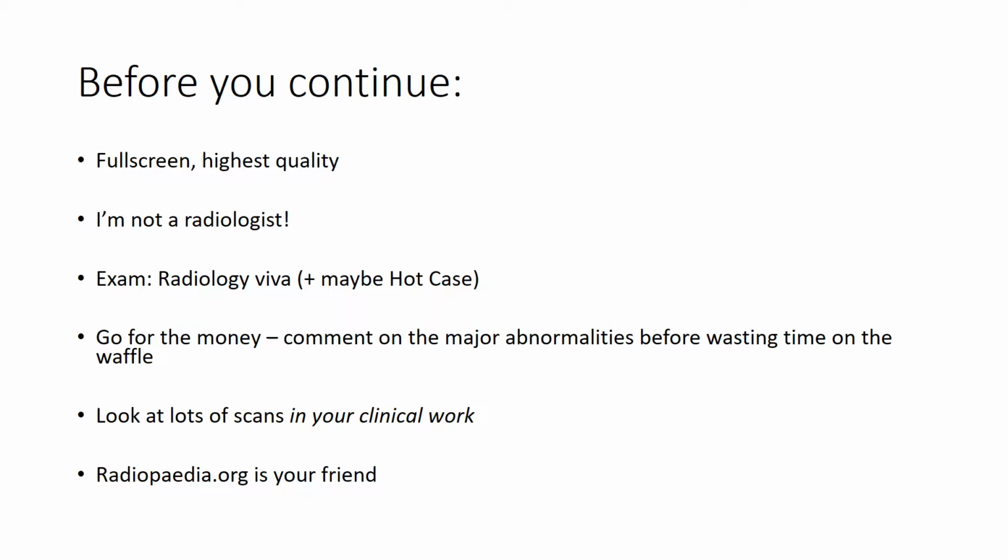I don't think it's controversial to say that trying to report these scans like a radiologist is not going to be the best use of your time. My tip would be to go straight for the main abnormalities because that's where the money is and your time is short. So how to best prepare? Well, it's like every other aspect of the fellowship exam. If you've done it 1,000 times before, it'll be noticed on the day and you'll be fine.